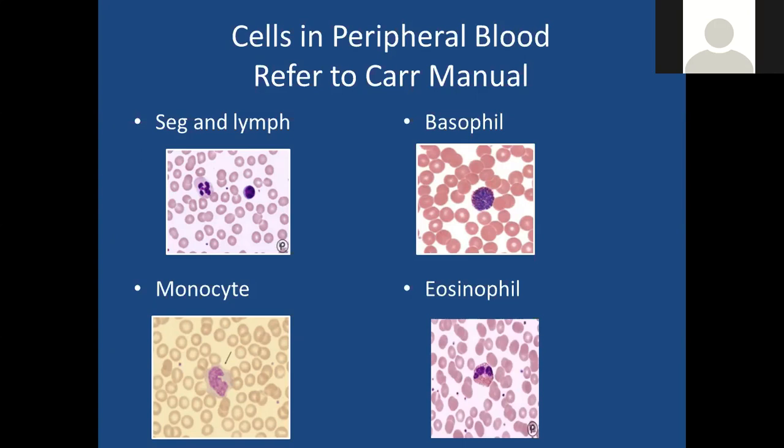A lot of students have a hard time differentiating a lymphocyte from a myeloblast. Lymphocytes are smaller in size, and they have this very definite nucleus chromatin clumping. So don't put a lymphocyte in your field of view and try to tell me it's a blast. If it has this very dark nucleus, it's not a blast. We're going to do some side-by-side comparisons, a blast versus a lymphocyte.